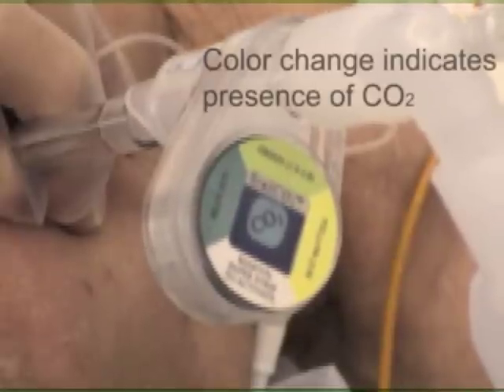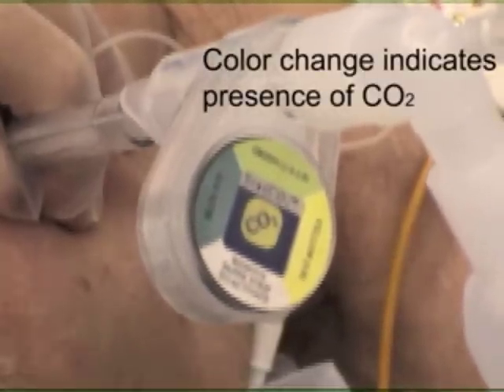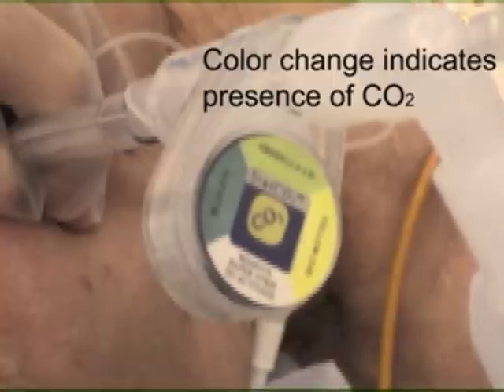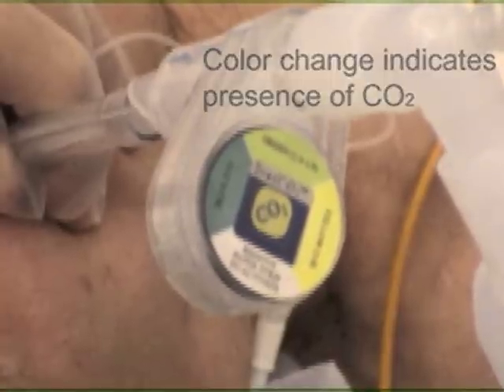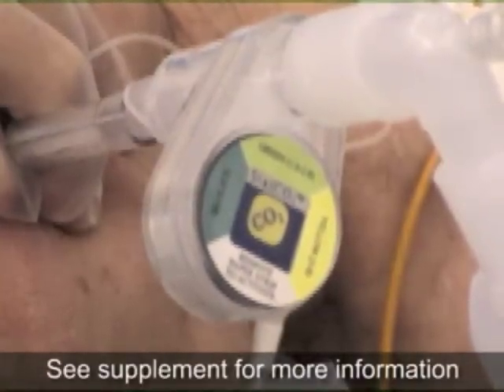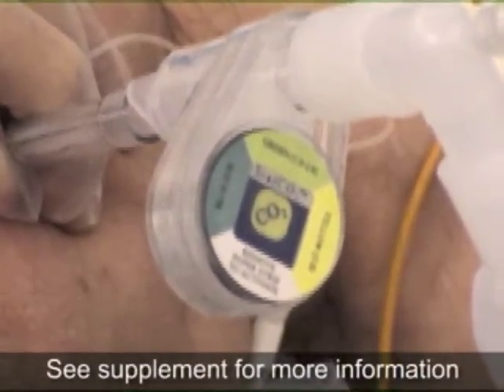Carbon dioxide will be reliably and consistently detected within the first 6 breaths of an endotracheal intubation, and with each exhalation thereafter, except in some cases of cardiac arrest when gas exchange may not occur.